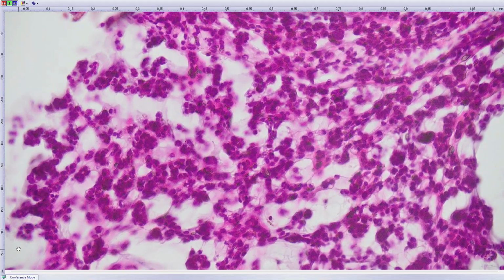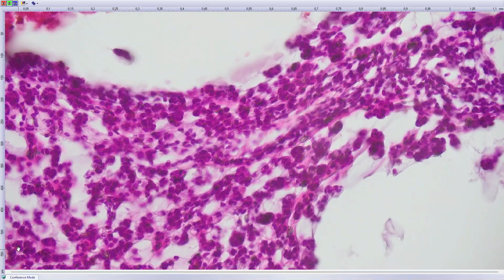So molecular studies are needed here. At that time it was an excellent diagnosis, now it is an even better diagnosis. Yeah, it's a wastebasket.